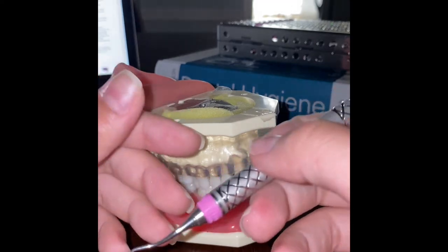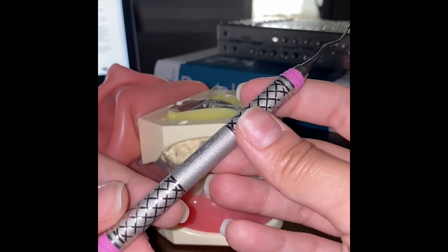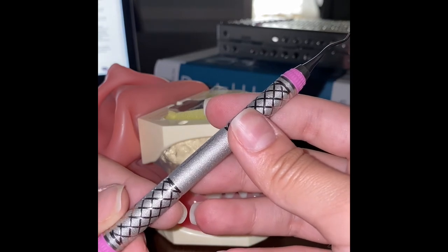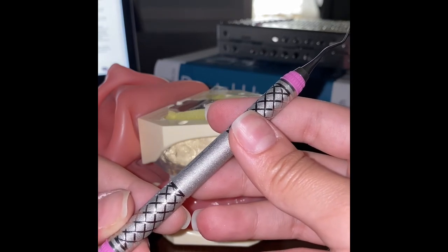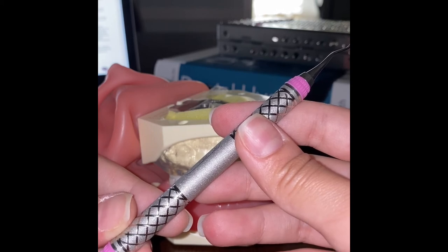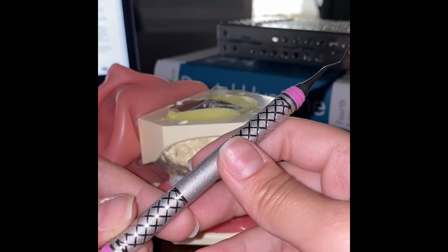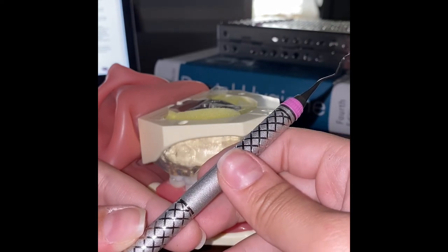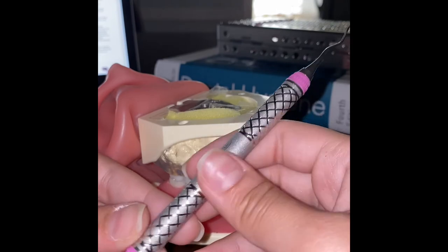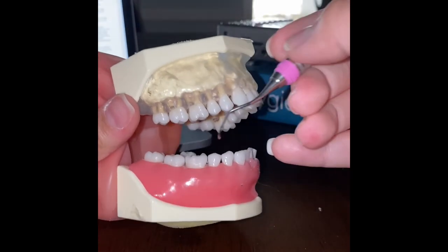Next, we'll look at the Gracie 13-14. The Gracie 13-14 is an area-specific curette that is only to be used on posterior teeth in the distal direction. We instrument from the most distal tooth forward. We begin at the distal line angle, work fully interproximal, remove the instrument, and begin working on the next tooth. I'll show this on teeth 30 and 29.